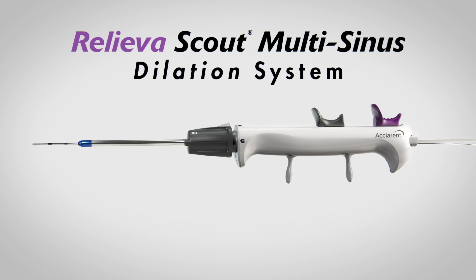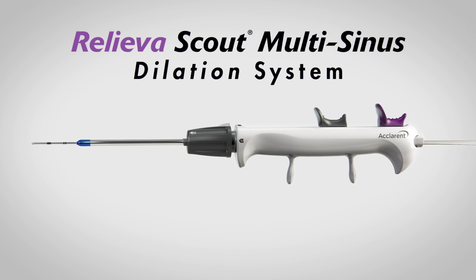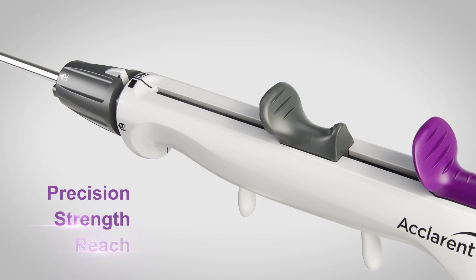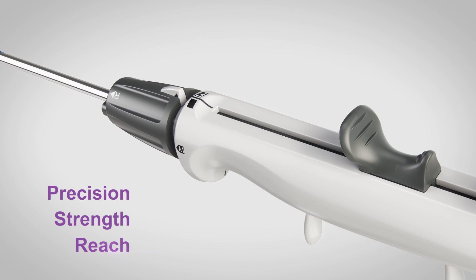The Relieva Scout Multi-Sinus Dilation System is an easy-to-use, fully integrated device, offering precision, strength, and reach to address your balloon sinuplasty needs.